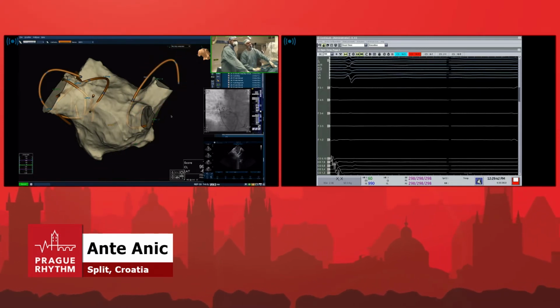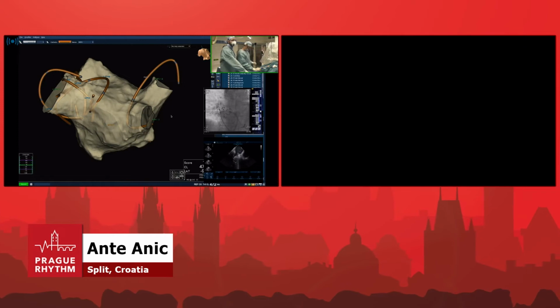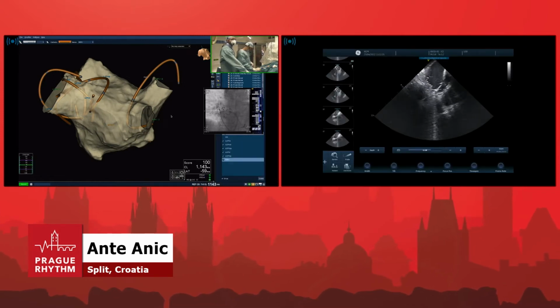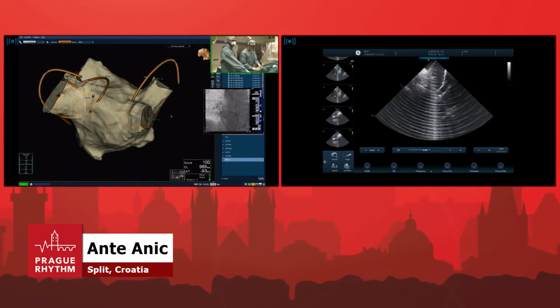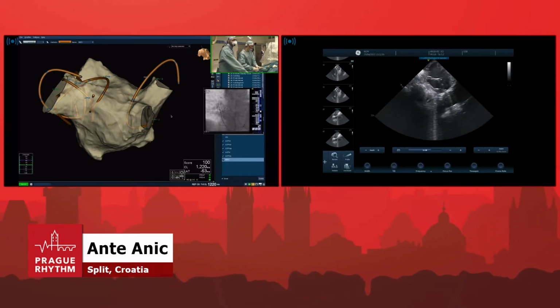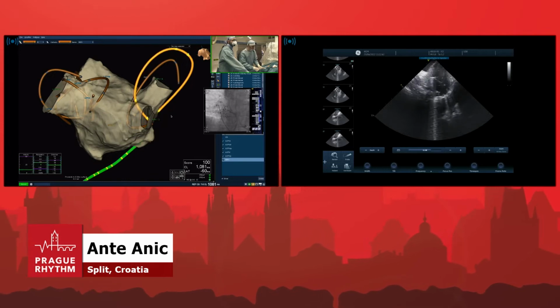You see how we embraced both parts, septal part and posterior part? I like this. Yeah, it's moving. Right inferior PV, pulse 6. ICE is very useful. I wouldn't say mandatory. Go. Thank you, Paul. Okay. Come back. I have to come back a bit. Rotate as much as we can. Good. Let's go here. Now I'm definitely touching the septal part. Right inferior PV, pulse 7.